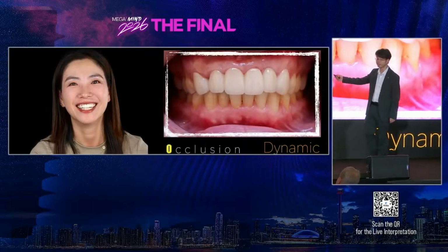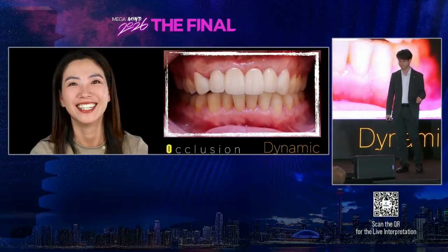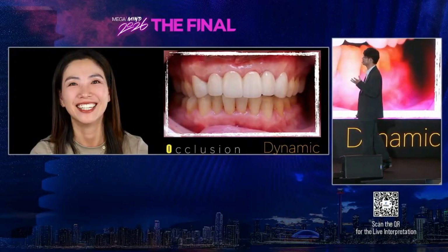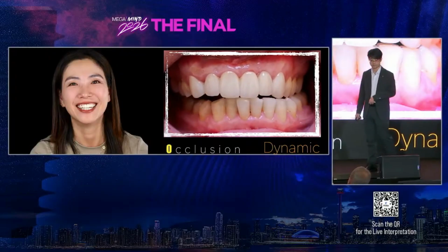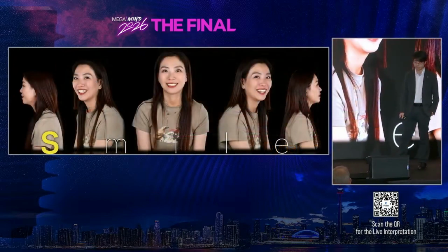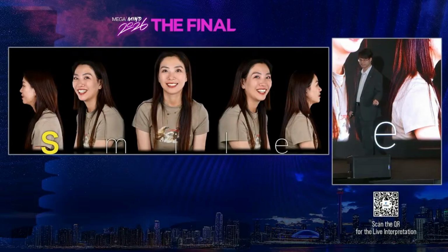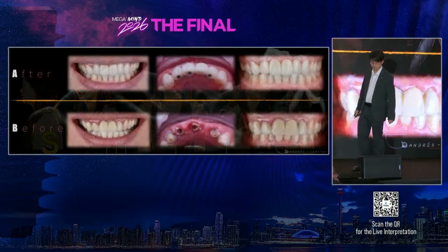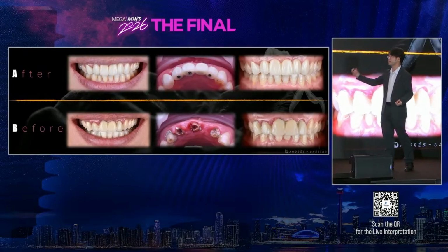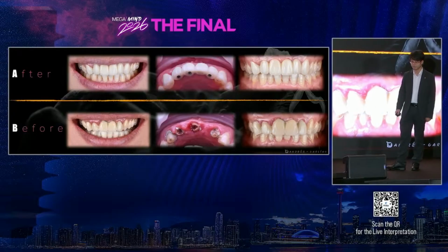And also this is the dynamic occlusion for the forward, right, and left side. It was stable and fluent, and this is the final smile of the patient. And we can see the change before and after on the anterior occlusion view.